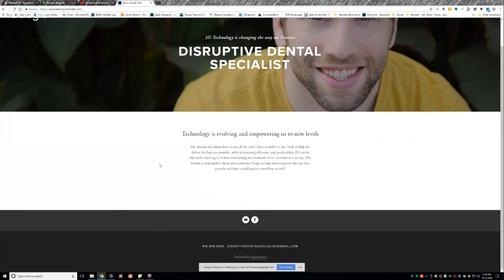Okay, so there's two possibilities for that question. Are there limitations for it over using another aligner system? I haven't found any. I do all of my aligner cases with BlueSkyPlan. Now, do I recommend everyone jump in the deep end like that? It's up to you at your comfort level, but the software works as effectively as I need it.